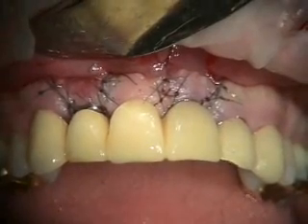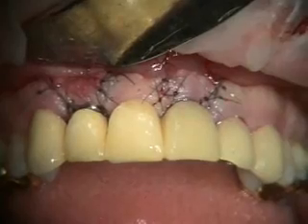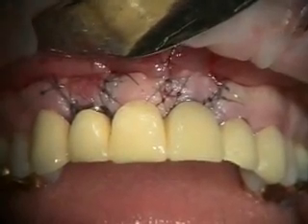So we got our bridge off, we got the two implants in the seven and nine sites, and our bridge is temporarily cemented. We'll take a look at this in a couple of weeks.